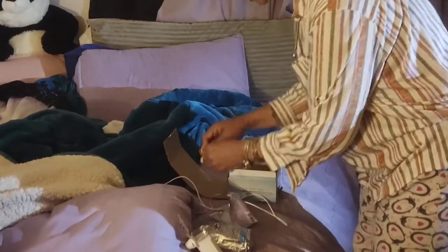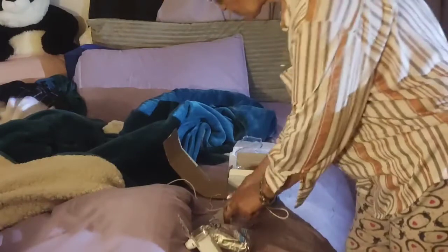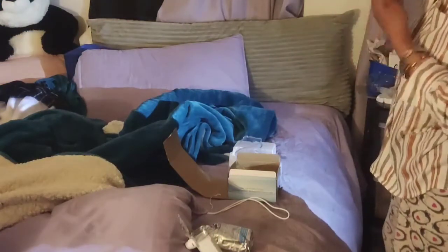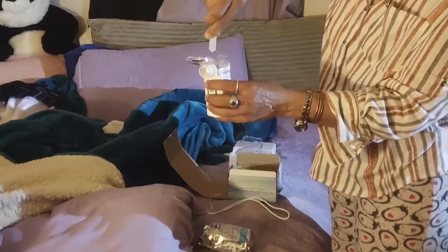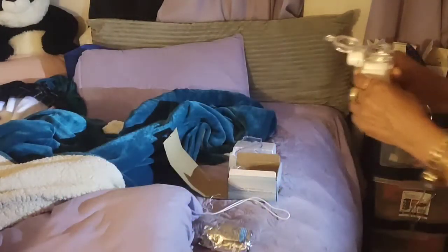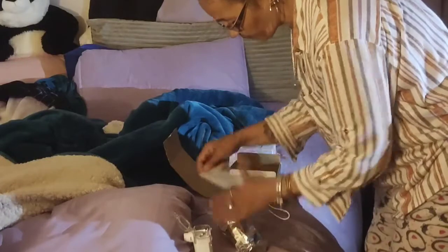Since I'm going to be at it anyway, I'm going to add the 2 liquids. This is budesonide. This is one type of liquid, and we put it in. And that's just one, okay? Look at it. I use 2 different liquids. Or if they prescribe you 2 vials, you see where the full line is, okay? You can't go past that. So that's normally what they prescribe you, 2 of what you use, or 1 and 1 of something different that you mix, that's all.